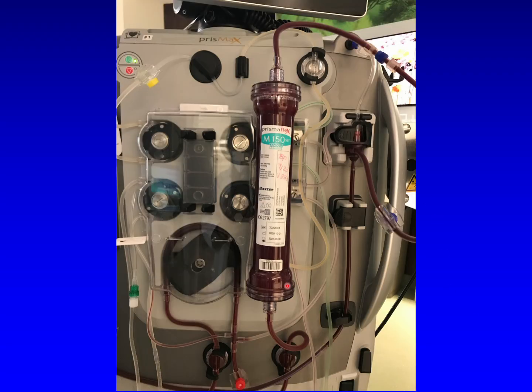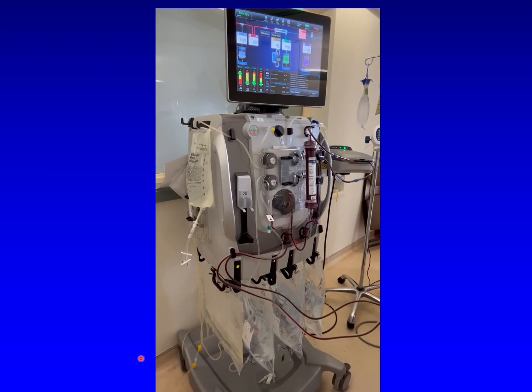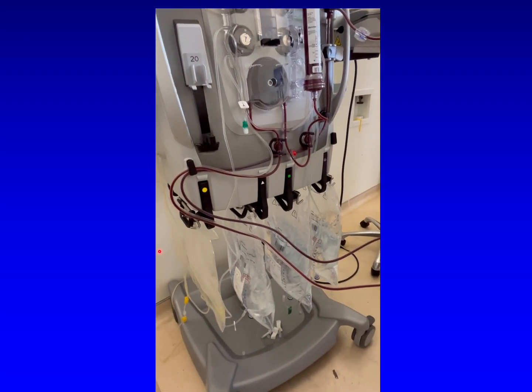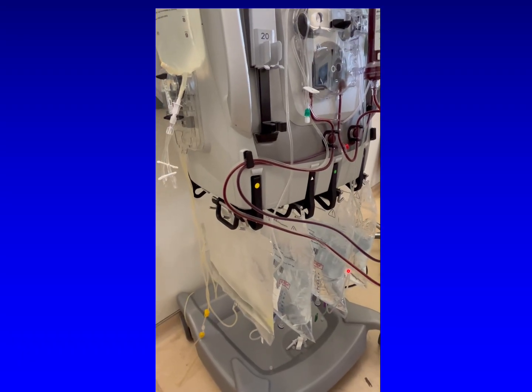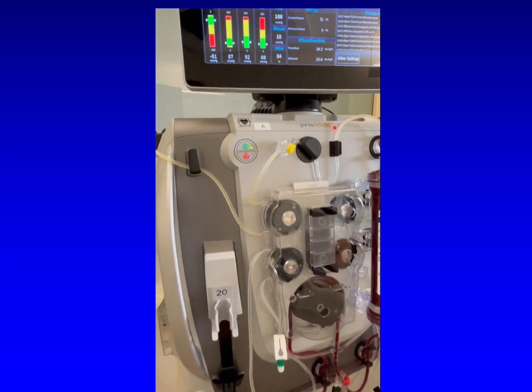Here's a close-up of the filter and the roller pump. And notice that there are 4 different wheels that are needed to control the rates of flow for the different parts of the process: blood flow, replacement fluid flow, dialysate flow, and ultrafiltration out of the plasma. And here's the way it looks in action with the hemofilter working and the various blood pumps doing their thing, ultrafiltrate being collected in the yellow bag, and the various bags of replacement fluid and dialysate fluid instilling their portions into the circuit.